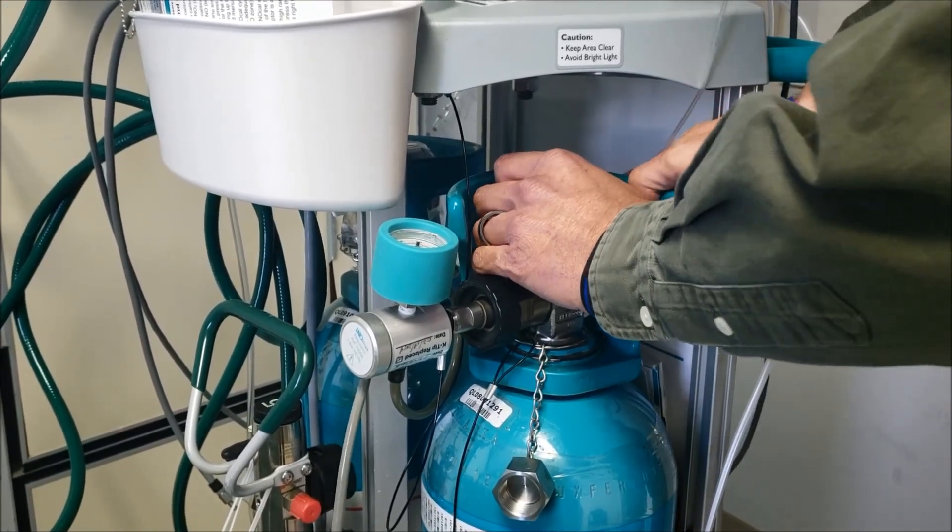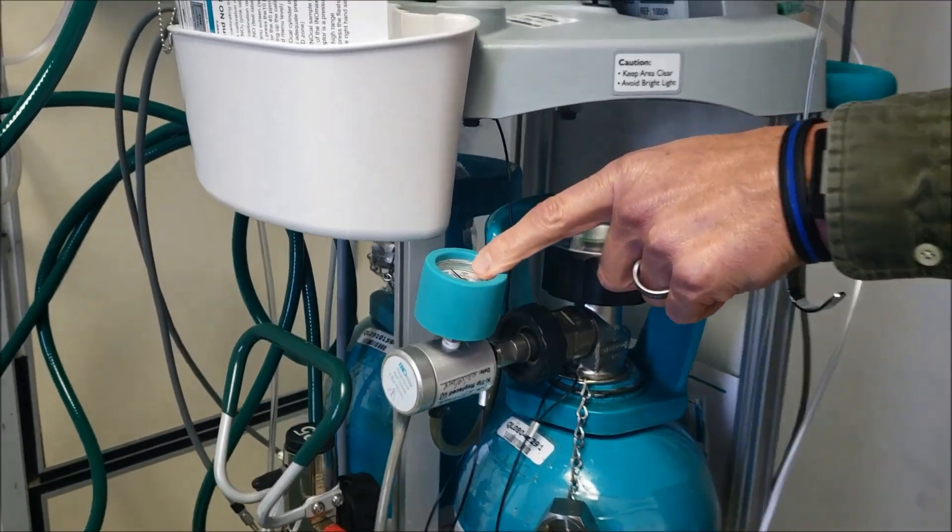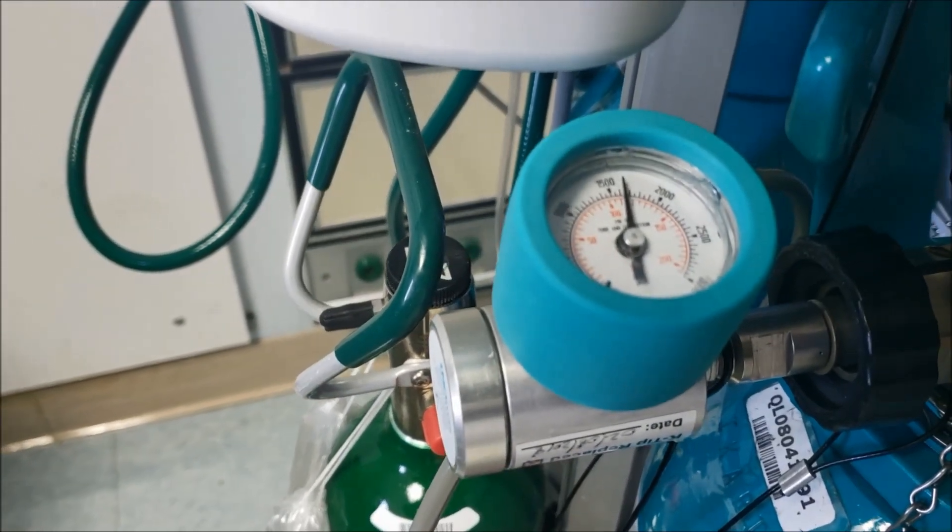So we're going to turn the tank on just like a normal tank. You're going to get a pressure on your pressure manometer here. We're showing about 1700 PSI on that tank.